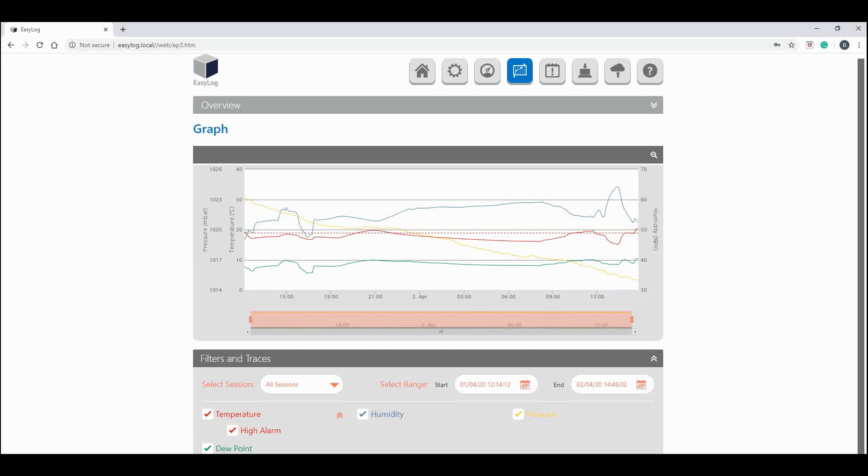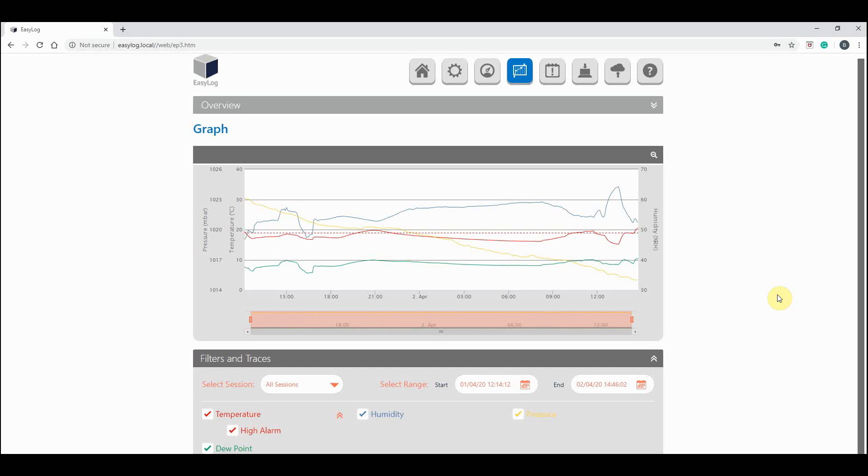Or you can pick a particular time period. Simply pick your date and time by entering it into these sections. You will also see the different parameters along the bottom here are all in different colors. These colors correspond to the colors in the graph.